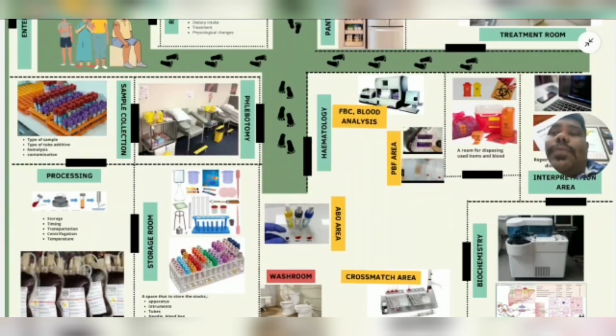For hematology, it will be something related to full blood count, blood analysis, whatever is related to blood, regarding our platelet count, our MCH, and all those materials. It will be under hematology.